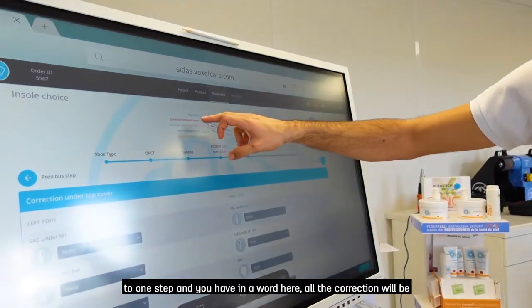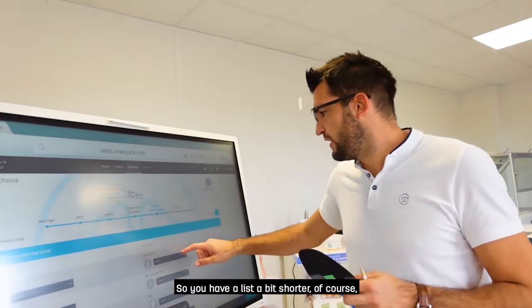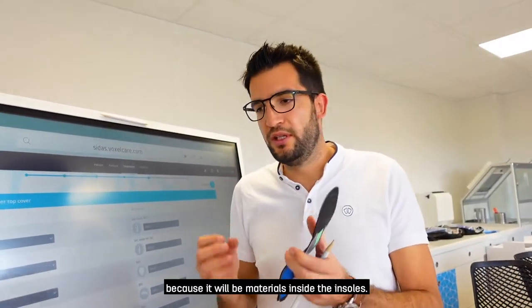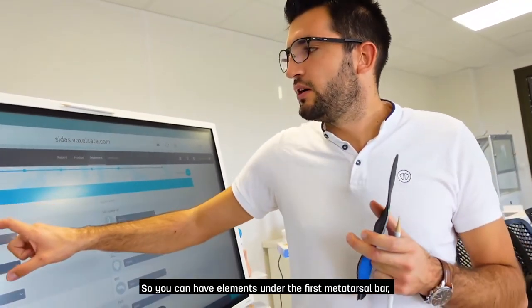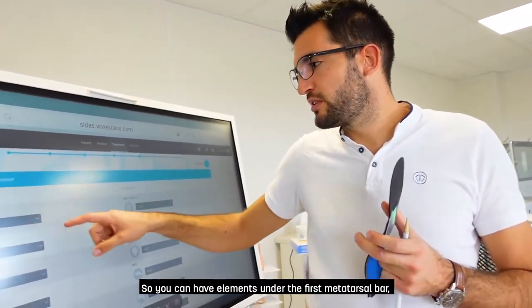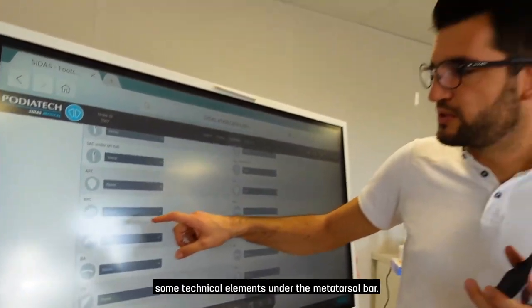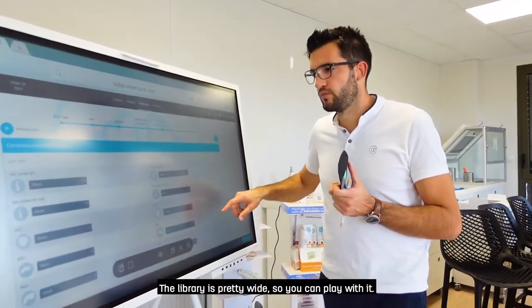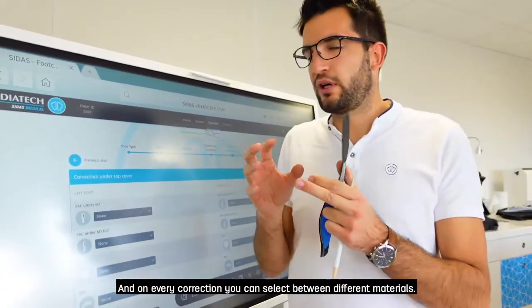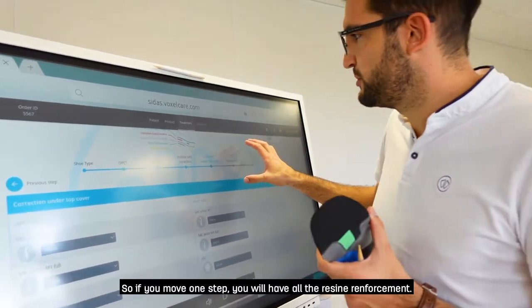The second category, shown in red, is Between-Layers corrections — materials added under the top cover. The list is shorter because these are physical materials added inside the insole. You can have elements under the first metatarsal, a metatarsal bar, a dome, or other technical elements under the metatarsal bones. The library is quite wide. On every correction you can also select between different materials.